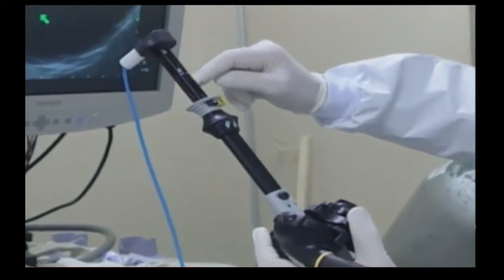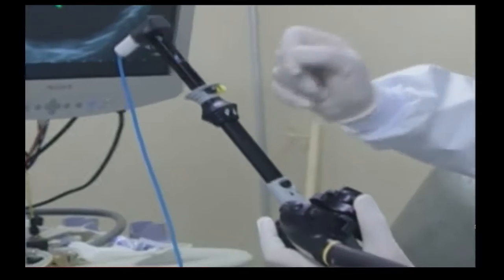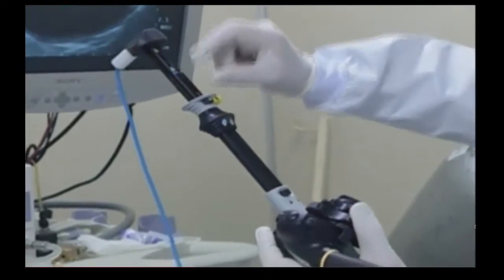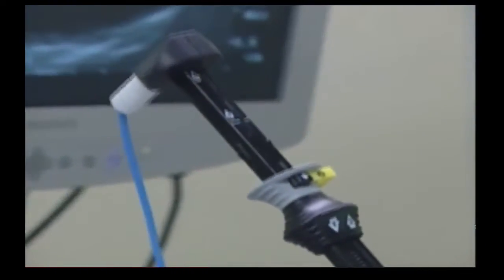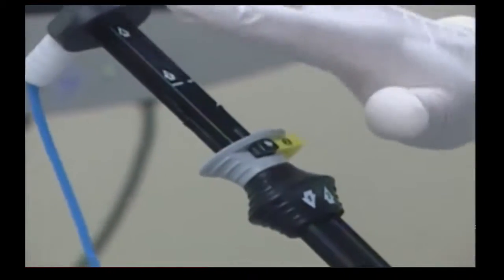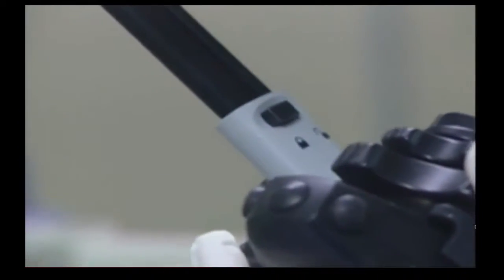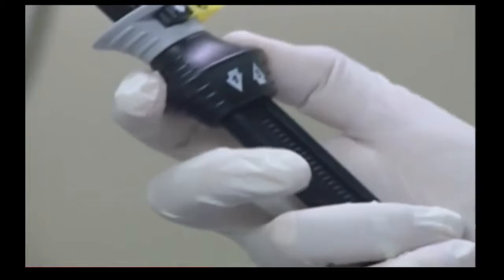You deploy the distal flange first, and it locks. And then when you're in good position, you deploy the proximal flange. So each of the flanges, distal and proximal, are deployed independent of one another. What's important is that everything is controlled by the operator just the same way that you do FNA. There are two locks here as safety guards, okay? So the first thing I'm going to do is unlock the sheath. And I can advance the sheath like this, pushing it forward.